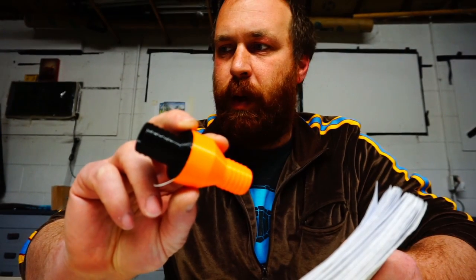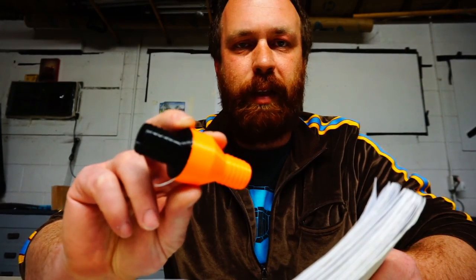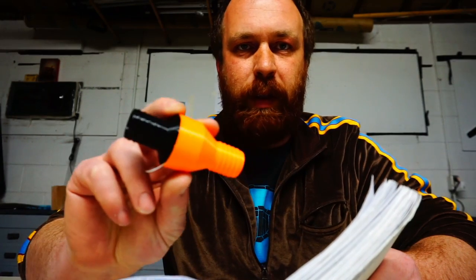It took me all day and about five or six tries to get this thing right. It would take me months to build a complete ventilator.